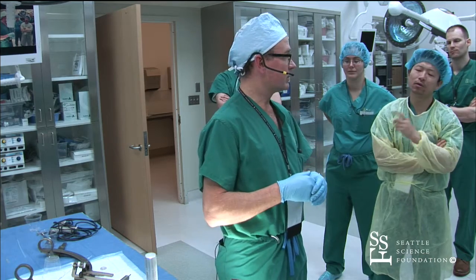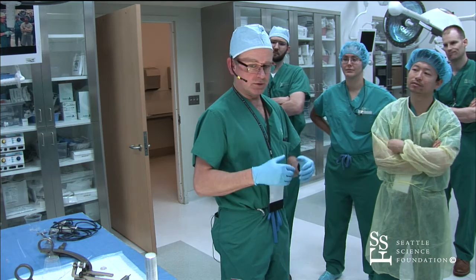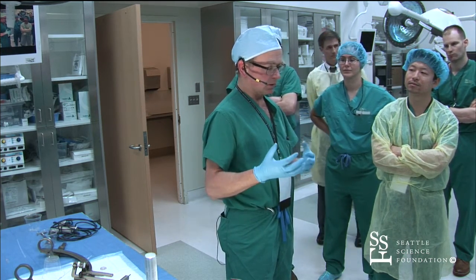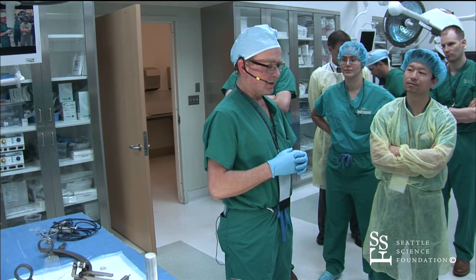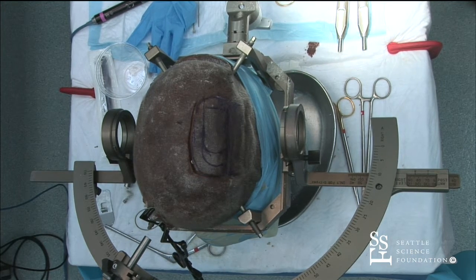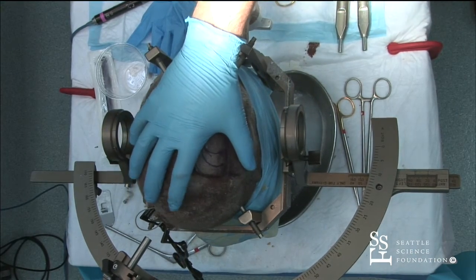Any other questions? Why can't you have a battery on the chest with an RNS? Yeah, well, it wasn't designed that way in the beginning, and the reason that I've been told and that makes sense to me is that this is an unamplified signal that's going from the cortex to the amplifiers in the device, and so while it's traveling through the wire, it's very subject to noise. Any movement of the wire can introduce a lot of noise into the system. So the idea was to keep everything as short as possible and as fixed as possible.